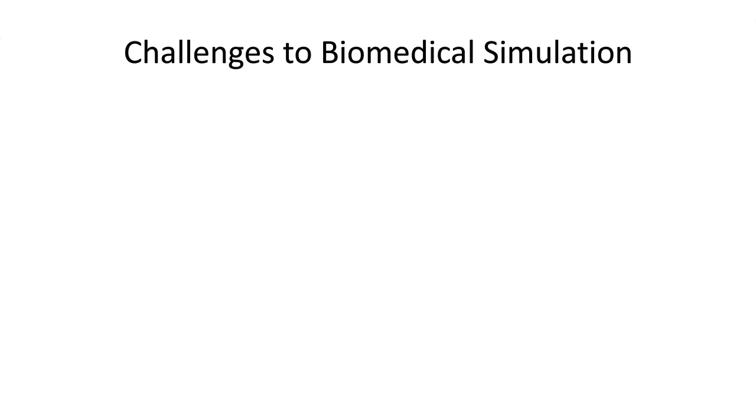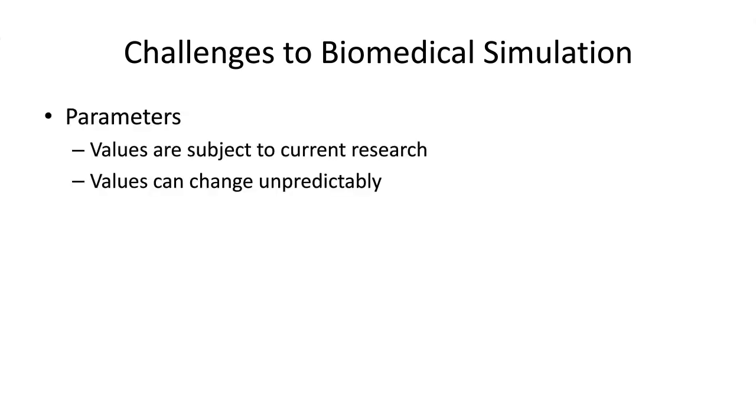But there are some challenges that are unique to biomedical simulation. The first challenge is specifying characteristics of materials. In our case, the materials are largely tissues, and finding those characteristics can be difficult. However, happily, I can show you that most of what we need for these kinds of simulations has been and continues to be the subject of pretty productive study. Less happily, the external values, what we think of as boundary conditions in simulation, aren't always stable, and they can be difficult to predict.